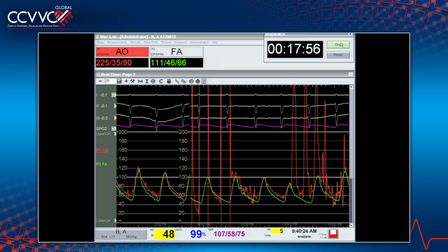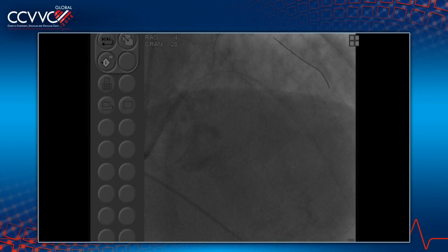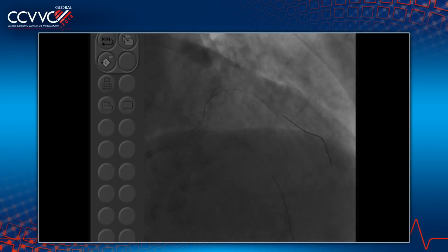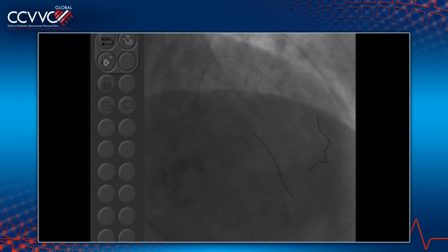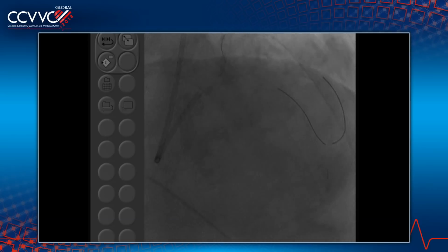I would just point out again, obviously, that because Samin is so experienced and so quick and so able to bail himself out of trouble, he can get by without doing hemodynamic support, but you may not feel... Do we have the sheaths on the right side or no? We have, yeah, the right side. Just to say, in this particular case, besides the valvuloplasty sheath, we have the 5 French sheath on the right side in case it needs it, so it can rapidly be converted into whatever device support we need, Impella, balloon pump, and so forth.